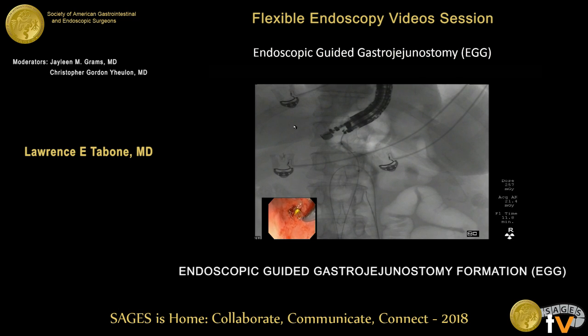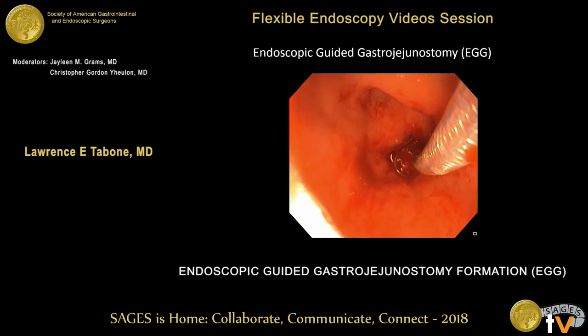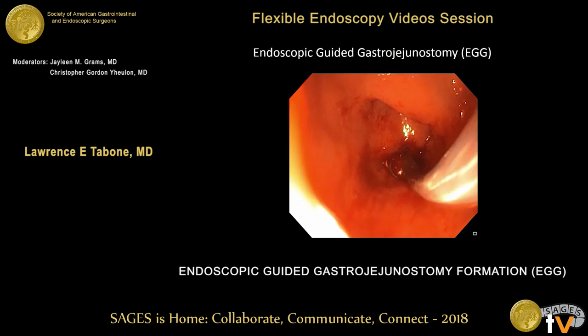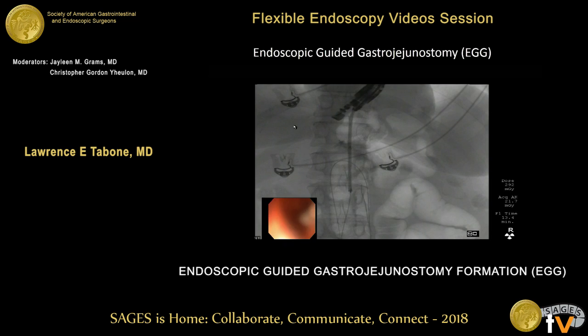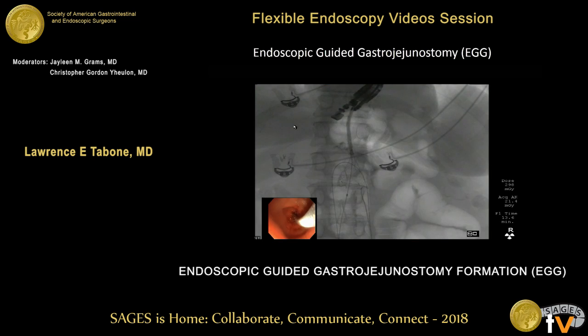We then took a 20-millimeter by 6-centimeter through-the-scope fully-covered stent, and under fluoroscopic guidance we advanced and positioned it so that the center of the stent was over the newly-formed gastrojejunostomy. We deployed the stent very cautiously and slowly to prevent any stent movement so that it was dead center on the gastrojejunostomy.